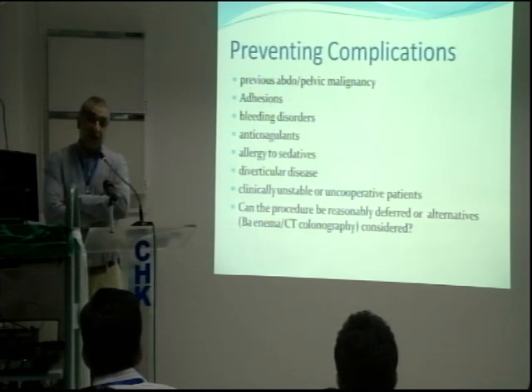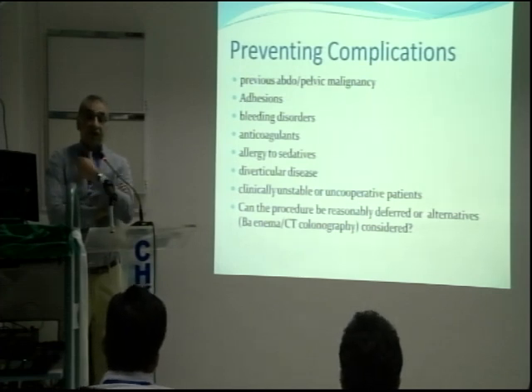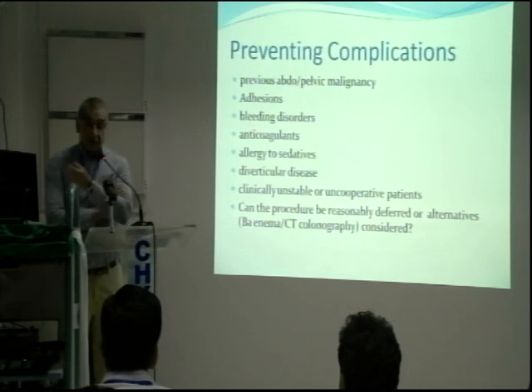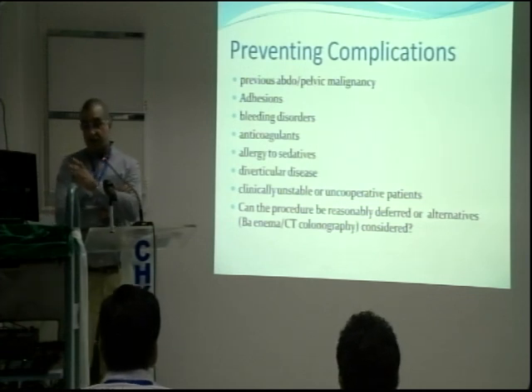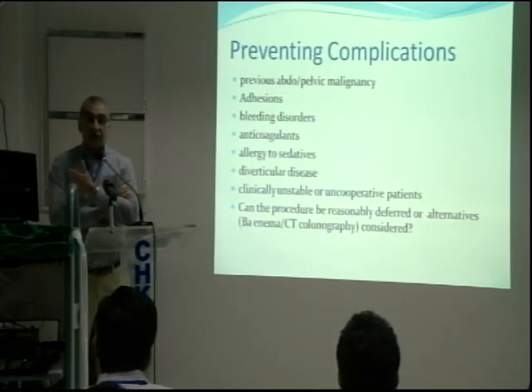Especially not in this country, but in the UK and in the West, diverticular disease is very common and it can be very complex because at times you can't even tell which is the true lumen and which is the diverticulum, and people can go through it. So always be careful. Patients who are clinically unstable, hemodynamically unstable, respiratory or cardiovascularly unstable, you shouldn't try to do any invasive procedure in those unless you are doing it as a life-saving procedure.